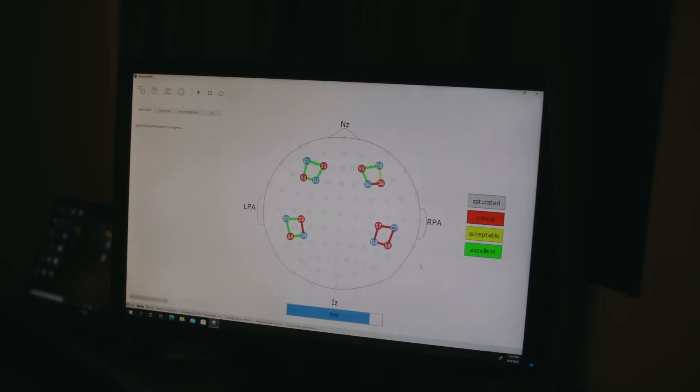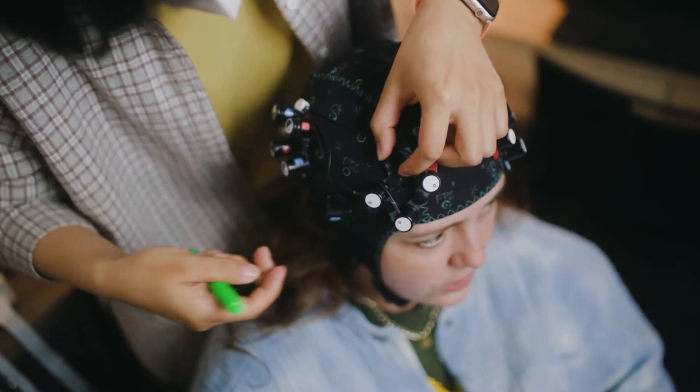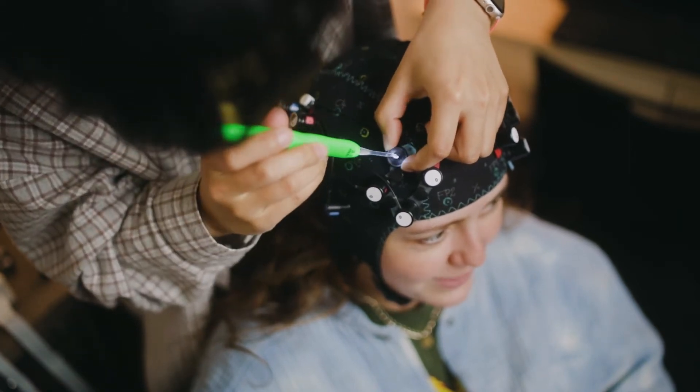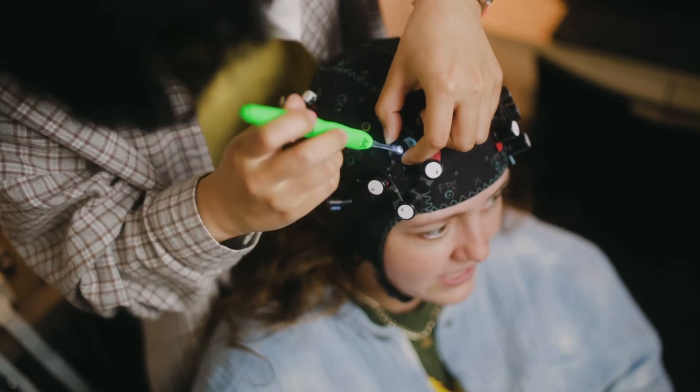If there are any acceptable or critical signals, Ying will adjust them on the cap and then rerun signal optimization to see if the signal is fixed. The channels that are red are in critical signal — no signal at all. Yellow is acceptable signal, but we would like excellent green signal.